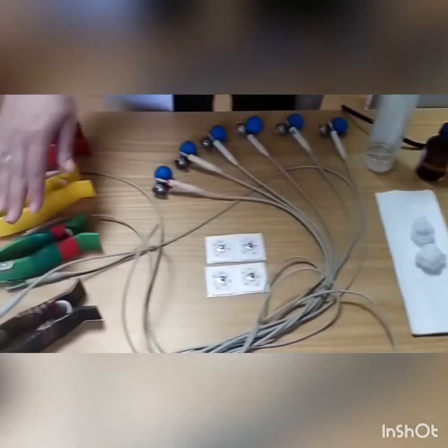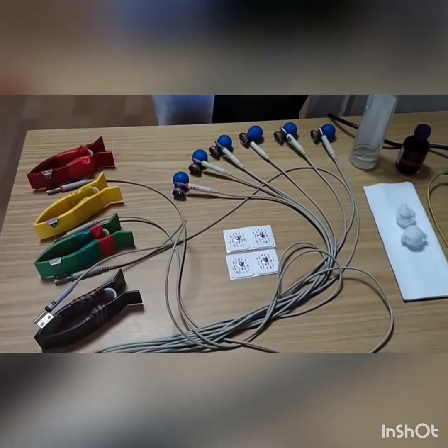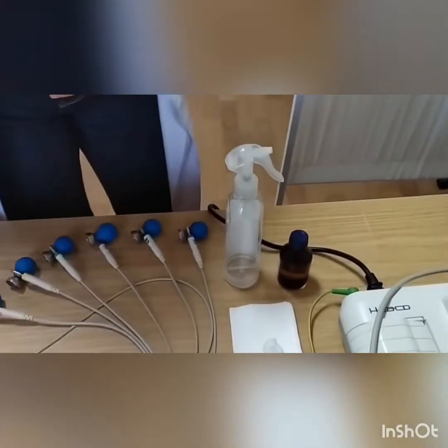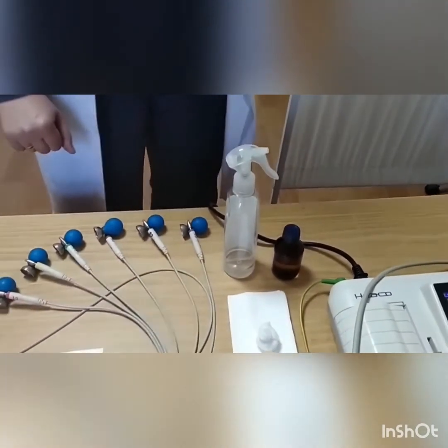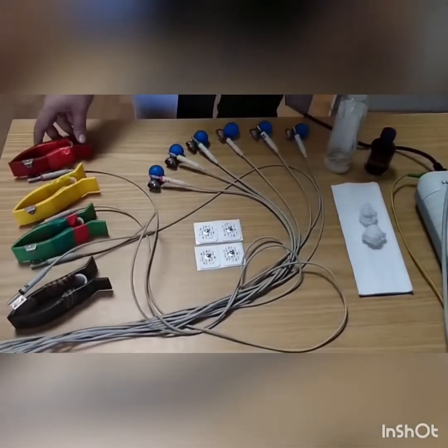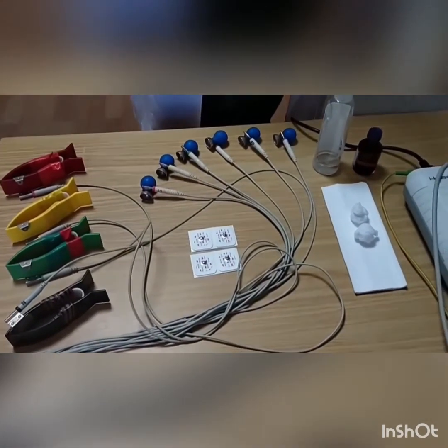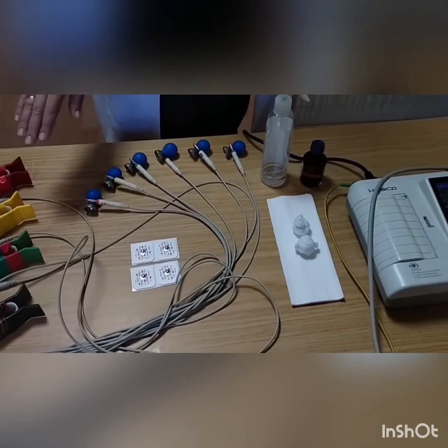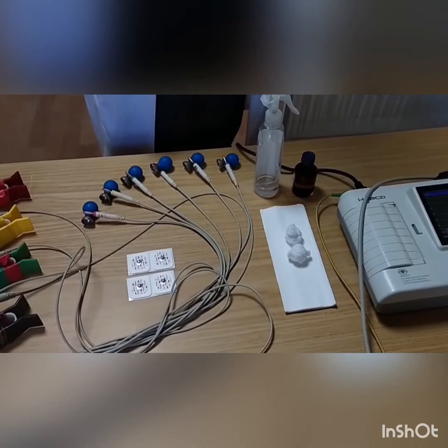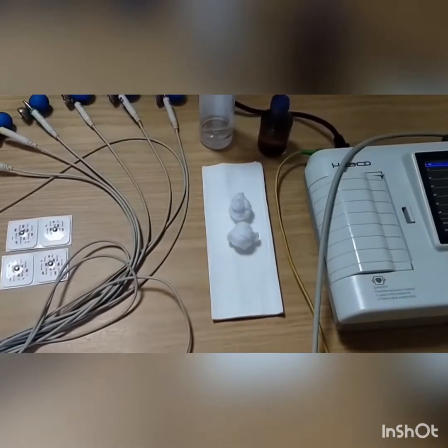For better electrical impulse conductivity, for reusable electrodes, we can take an EKG gel that is applied directly to the electrode. Or we can use a saline solution that is applied to the surface of the human body where the electrode will attach. There are also times when it is necessary to degrease the body surface in the area where the electrodes will be applied. This mainly happens when performing electrocardiography in adolescents. We use an alcohol solution and cotton balls.